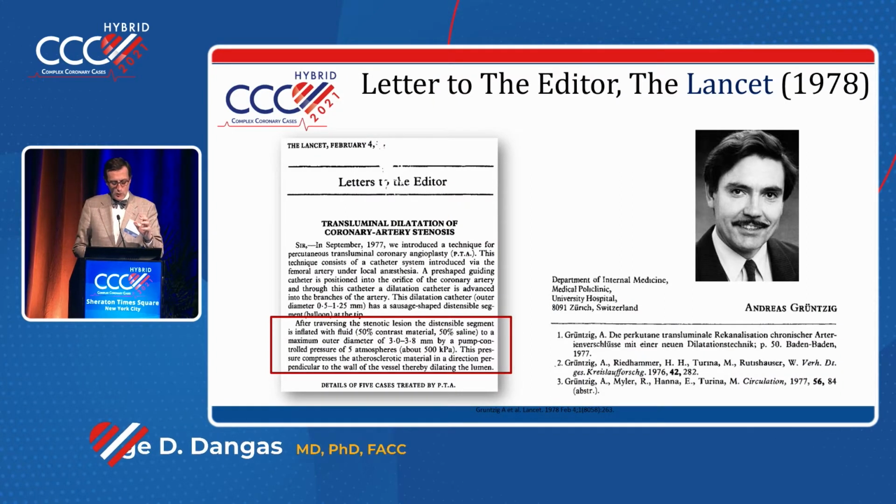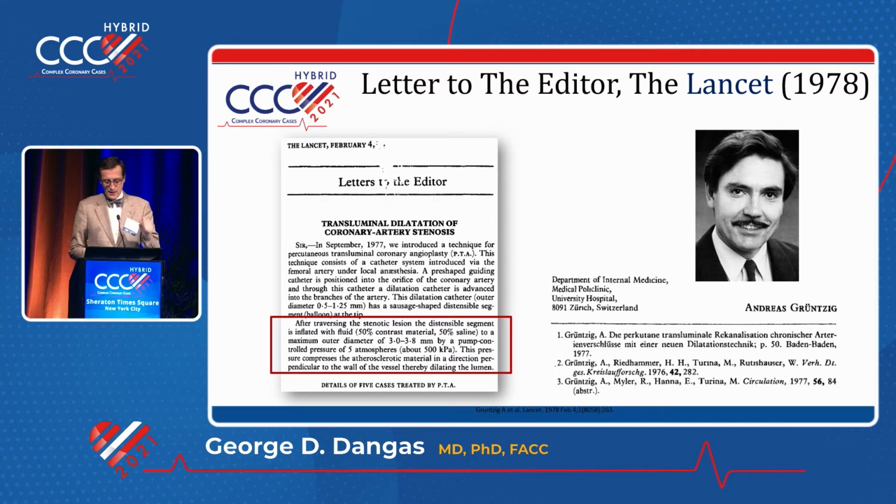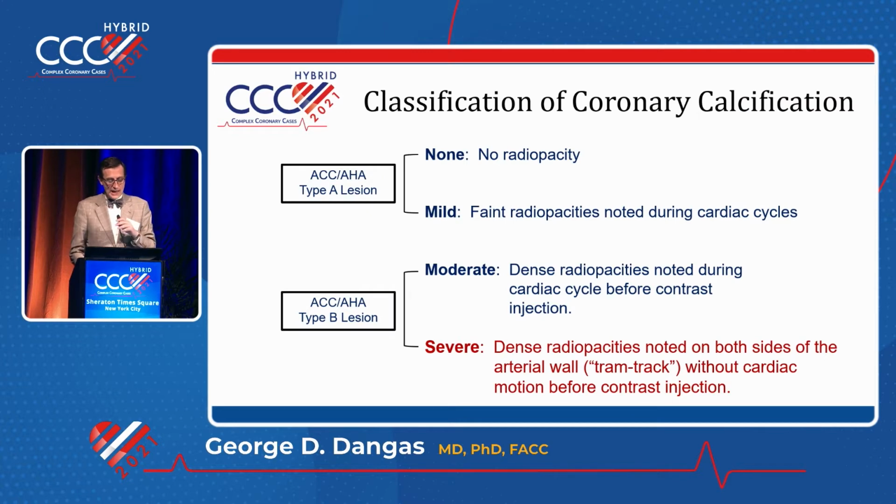You can see how well Dr. Grunzik had described exactly what happens to the plaque, that this compresses it and opens it and all that. So obviously the natural situation was that initially you needed to have a compressible plaque. And later on, when the plaques become harder perhaps, when we learn more, could we remove some of that plaque? And that's where the calcification comes in.